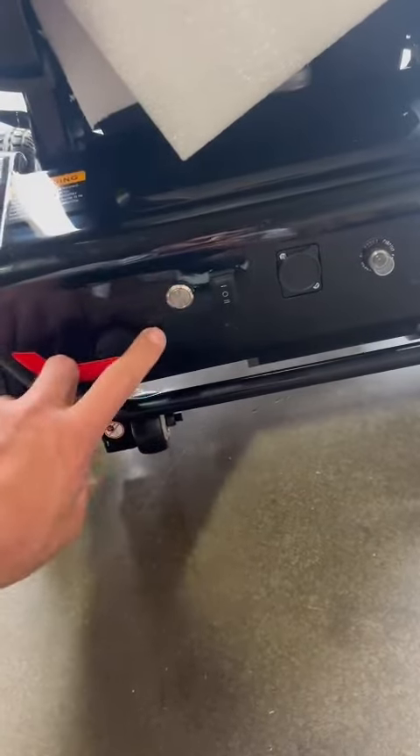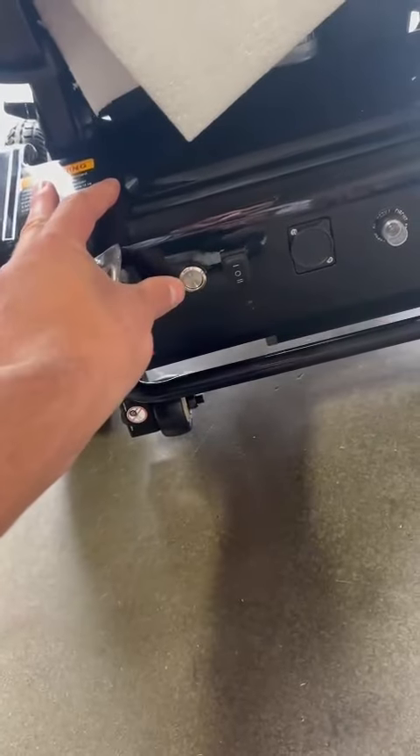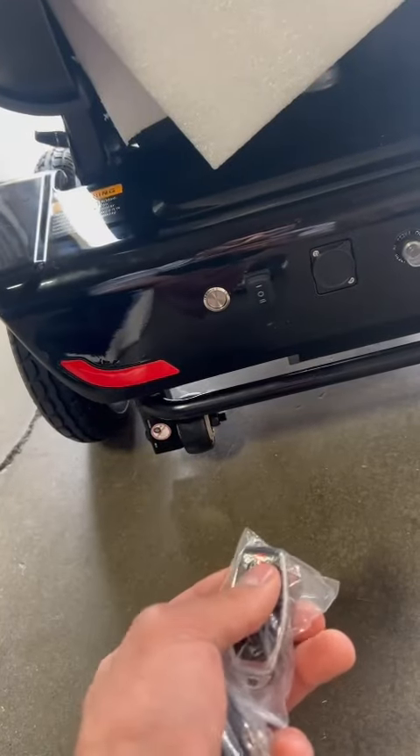If you don't press this button, it will not work. Press this, it goes inside, then it will work. Otherwise, you will not see that it's working, okay?